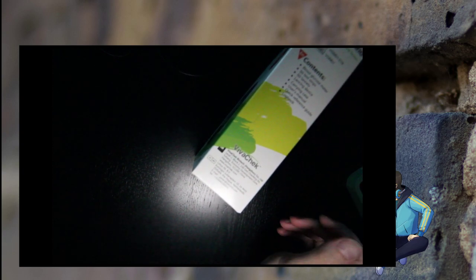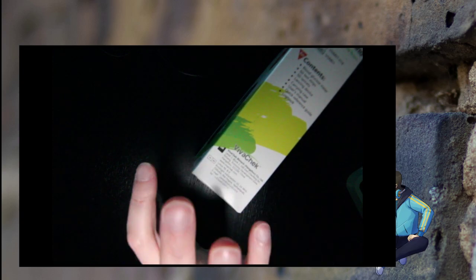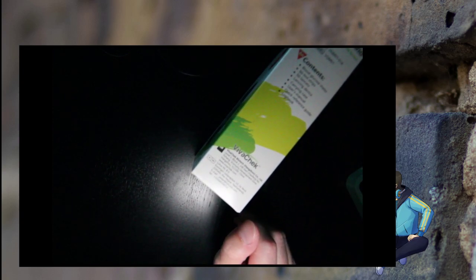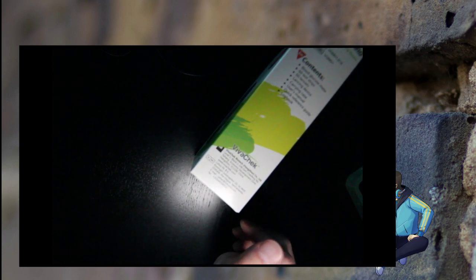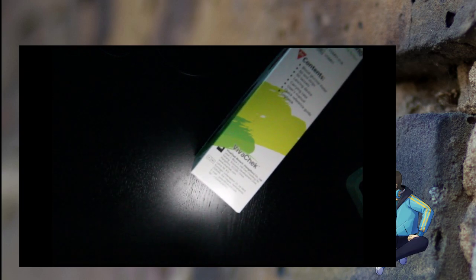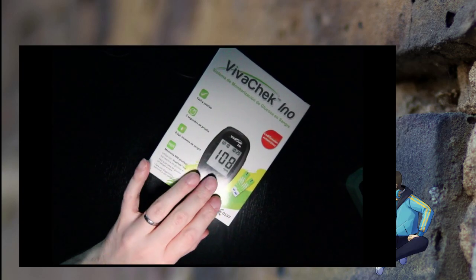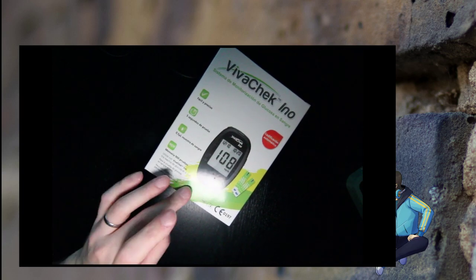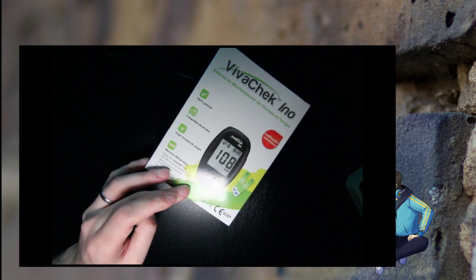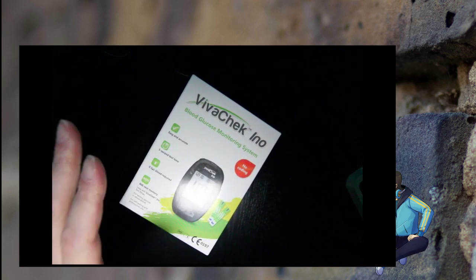it's made by VivaCheck Biotech in Hangzhou, and distributed in Europe at least, it seems, by Lotus NL in the Netherlands, in The Hague. Never heard of this brand, VivaCheck. Have no idea how well or how badly this works. It seems to be common in India. And somehow this is in English and in Spanish. So that's the English version. No coding. For those who are wondering, I'll explain as I go.